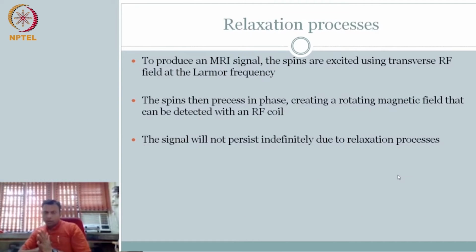So now we need to talk about exciting. Exciting something is fine, but then excitation cannot survive for long. The moment the excitation pulse has done its job, that is, pushed, you have had the excitation pulse on for tau p. So you made sure that you pushed it. I'm just deliberately stopping somewhere. If it is a 90 degree pulse, it would have been like this. I can stop anywhere I want. So I've essentially excited it. It is now there, and some signal is there.